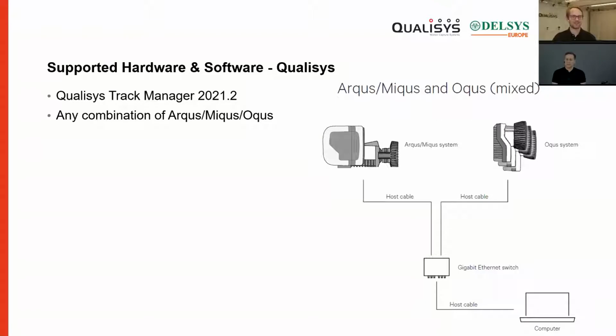Perfect. Thank you very much, Steven. So let's take a look at how we support the new integration in Qualisys Track Manager. What do you need from the Qualisys side to run this? Basically, we have implemented this new integration in Qualisys Track Manager 2021.2, and that version was released just a few weeks ago.